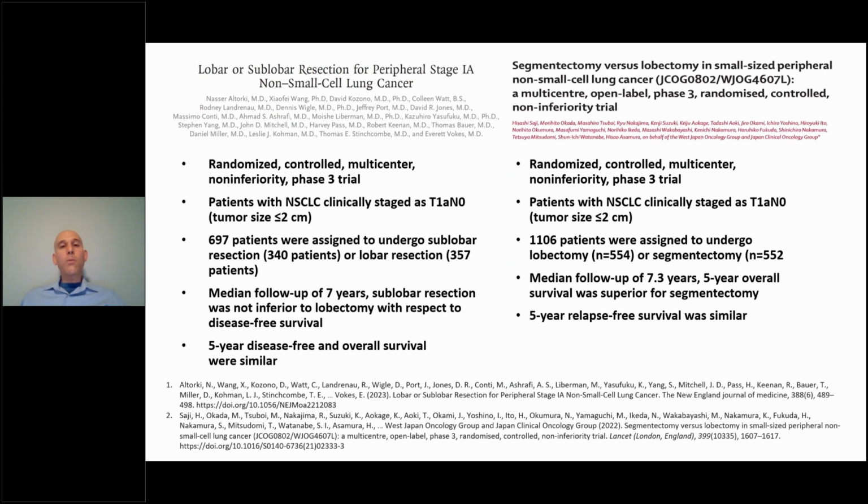So this is a really big change in our practice, where if we previously had found the nodule, we said, well, we're going to remove this surgically, and that's going to be a lobectomy, and then we're going to move forward with the patient's care and follow-up, etc. But now there's more and more evidence to support changing the way that we're practicing, and it's becoming more and more clear that really when we want to remove something surgically, we want to try to do that in the most minimally impactful and lung-sparing approach as we can. And bronchoscopy with marking of these lesions really has a tremendous potential to impact that process moving forward.